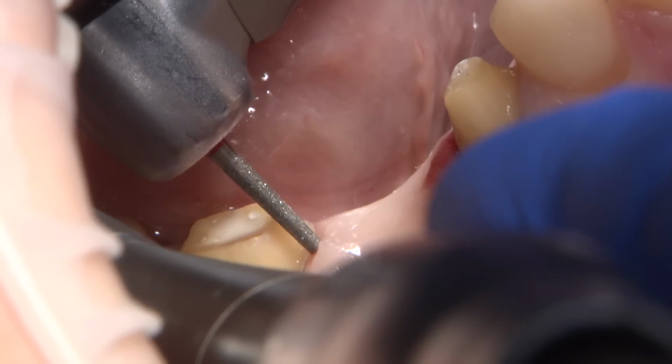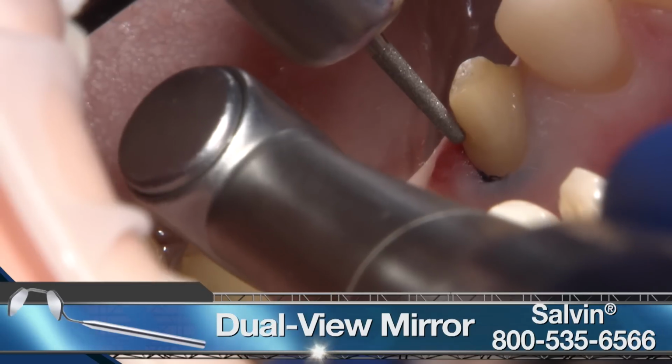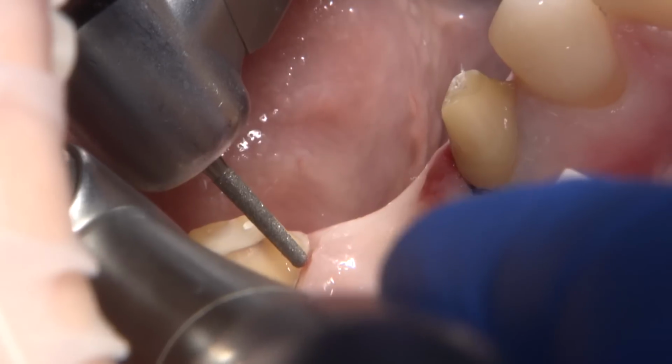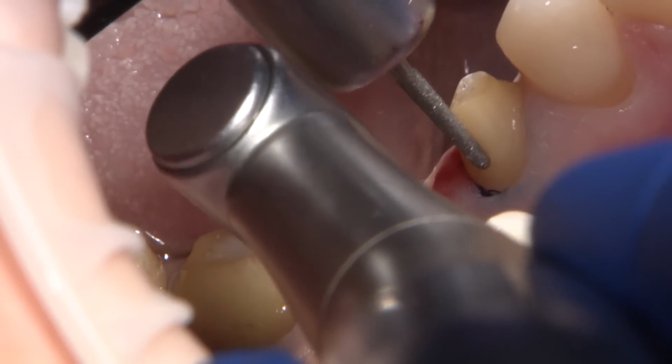To minimize the discrepancy in axial inclination between abutments, what I found useful is to view both preps in my dual view mirror. Or, I sometimes rely on my assistant to hold a long mirror to provide me with the indirect view of both preps.